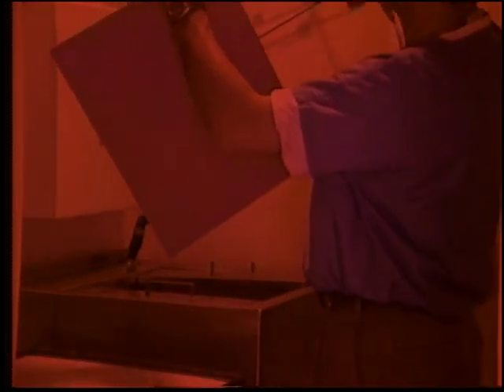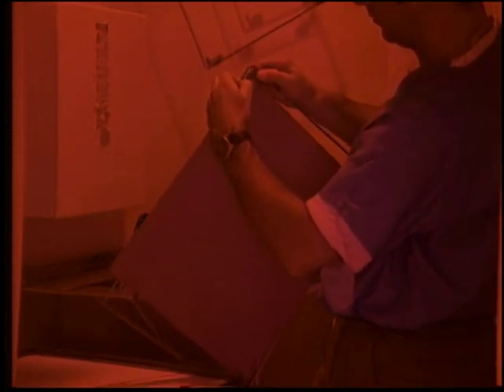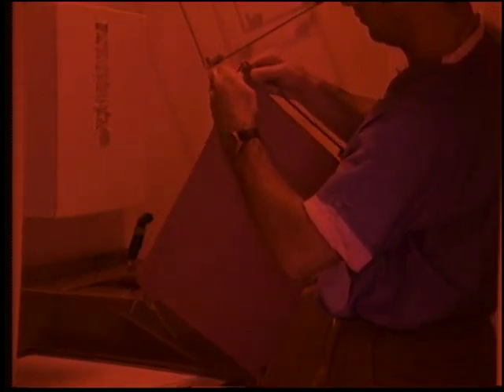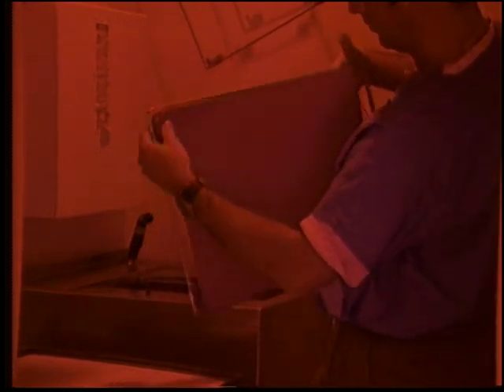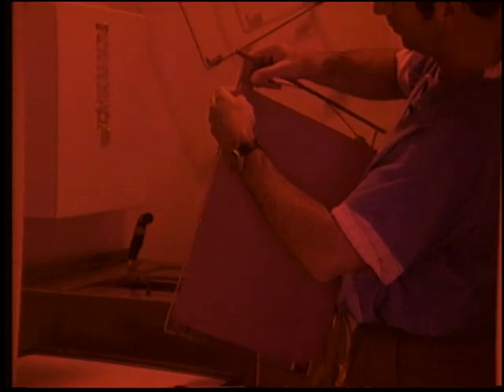The cassette is opened and the film is carefully removed from the cassette, handling it only by its corners. It is loaded into a film rack by attaching a clip to each corner of the film. The clips at the bottom of the rack should be attached first, allowing the top clips to stretch the film with their spring-like action. The film rack is then placed into the developing tank.